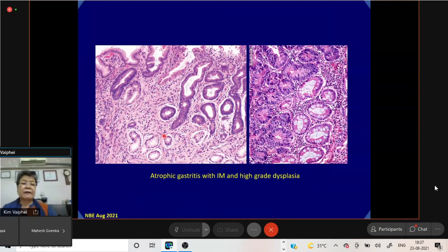And now this is another pattern of atrophic gastritis in contrast to the other one which we just saw. And here there is replacement fibrosis, extensive replacement fibrosis, and the glands are also very extensively coiled. And there are few, just like the antral glands, mucous glands left over.